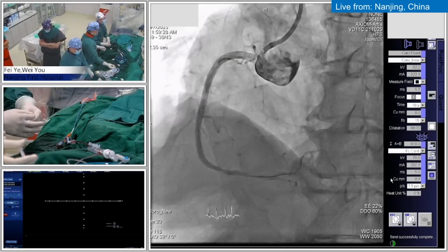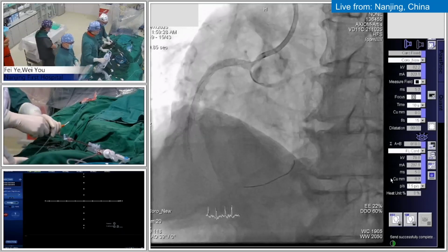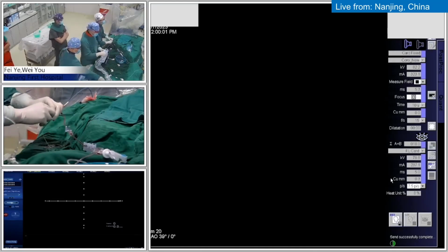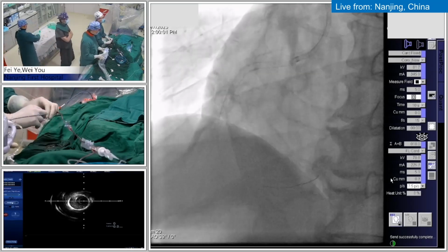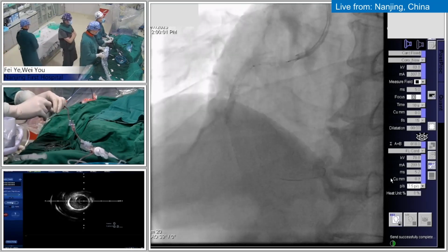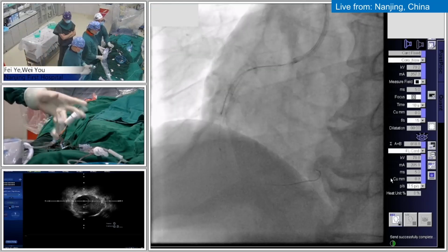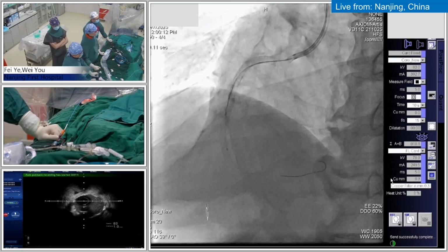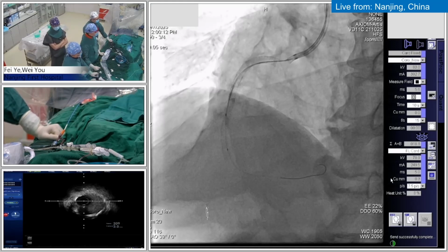Sometimes we don't use intravascular image guidance for calcification. We make sure a 1-to-1 NC balloon predilates the lesion fully, which means predilation with a balloon for expansion before stenting is very, very important. 1-to-1 is a very, very important issue. We don't want to use a smaller balloon to predilate the lesion and after that put in a larger stent.